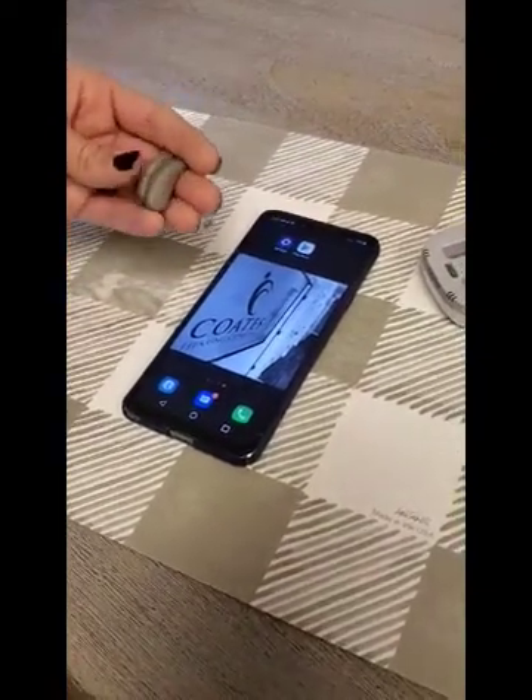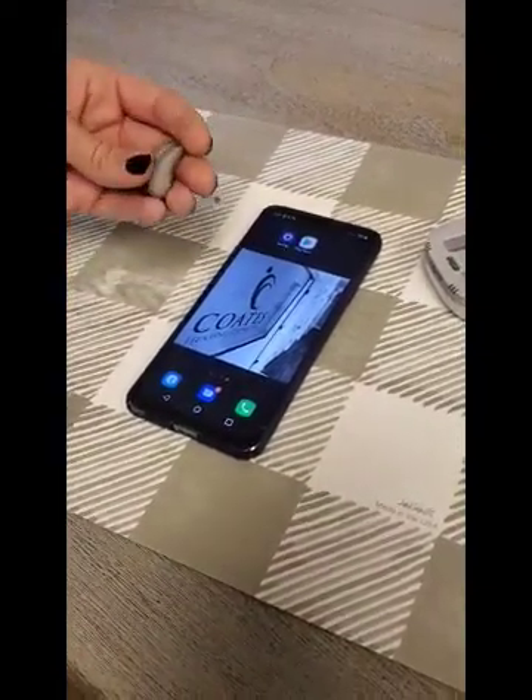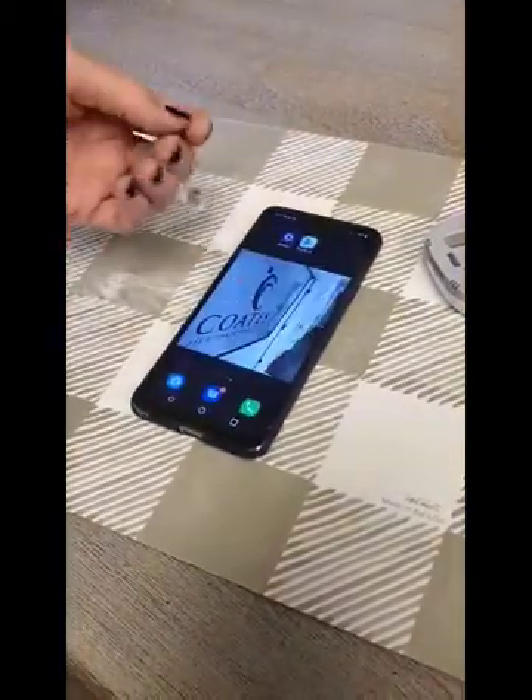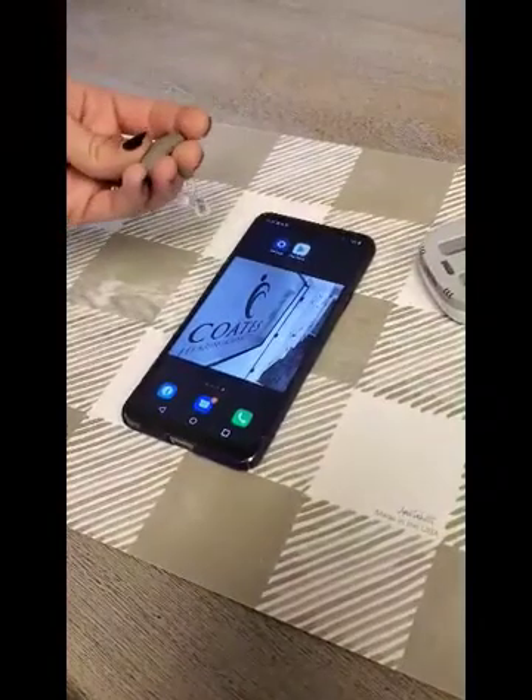Dr. Coates here. I'm going to show you how to connect your Signia Pure Charge and Go X, or the Pure X hearing aids, with the Signia app.